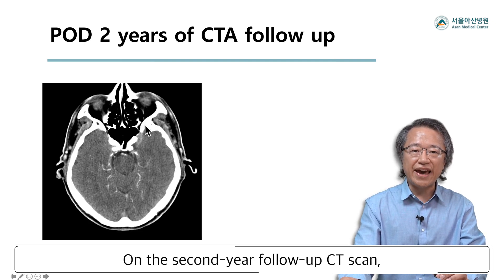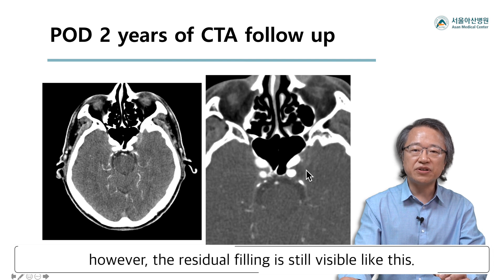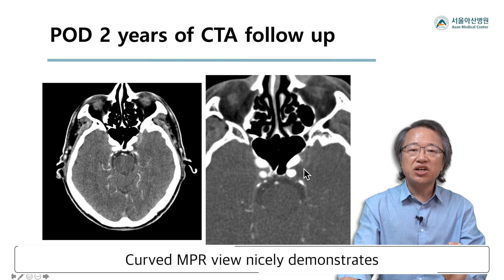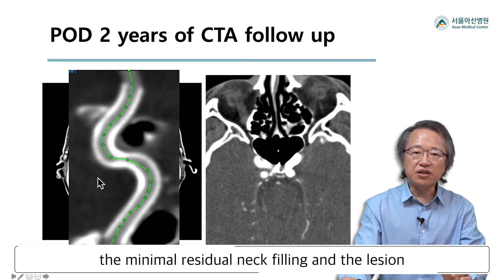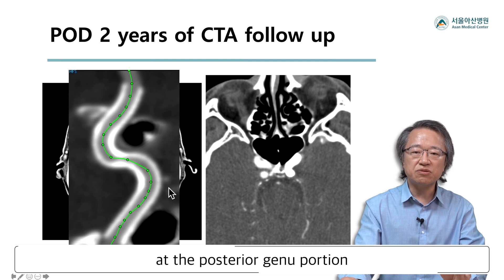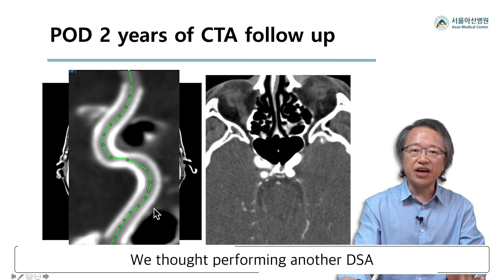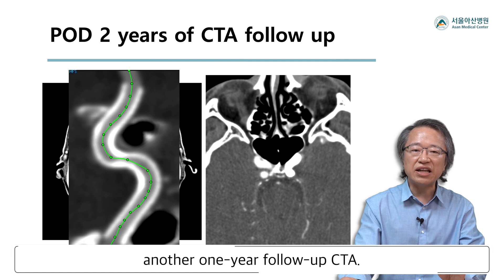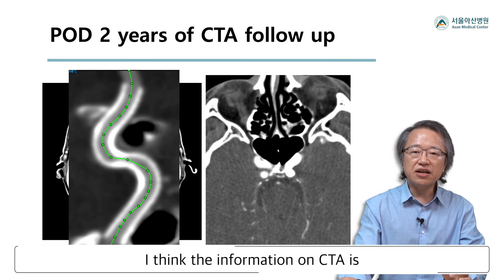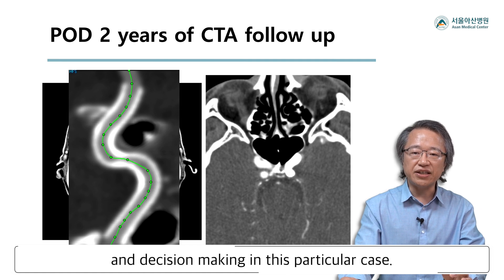On the second-year follow-up CT scan, the aneurysm itself is contracting more. When you look into the source images closely, however, the persistent filling is still visible. Curved MPR views demonstrate good parent artery patency and show the minimal residual neck filling and the lesion caused by poor wall apposition at the posterior genu portion of the cavernous segment of the ICA. We thought performing another DSA would not provide further additional information at this point, so we decided to put the patient on another one-year follow-up CTA. The information on CTA is enough for treatment outcome evaluation and decision-making in this particular case.